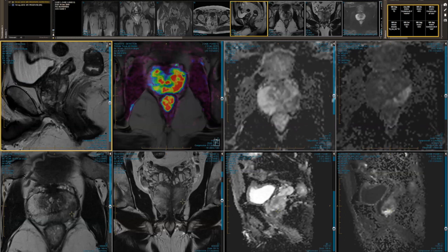Yeah, yeah. Look, I'd really like to echo that comment. Especially for people who are perhaps starting out to do prostate MRI, I think there's perhaps nothing more important than having that team of dedicated, interested people who are urologists, radiologists, and pathologists. That's how we started many years ago. I'm sure very similar to you, Clare and Veeru. And it's just been invaluable, the learning that we've had from the very beginning, and just having that instant feedback through those multidisciplinary teams is wonderful.